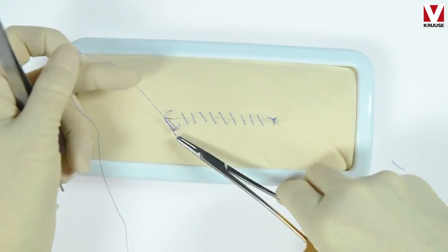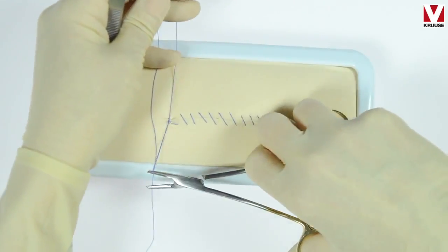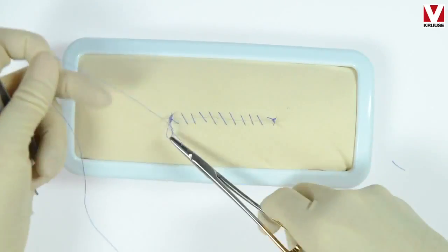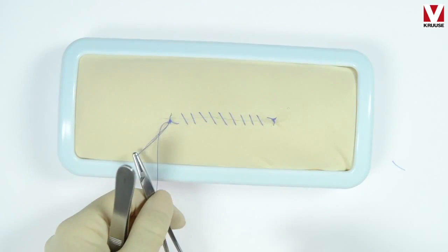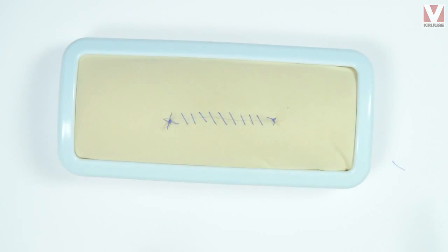Two throws. I grab the suture now with my needle holder. Because this bite of the suture, this piece of the suture, I will not use in my surgery. Then I cut the suturing ends. Not too long.